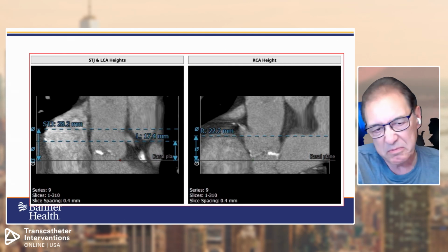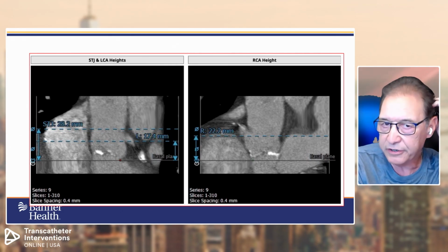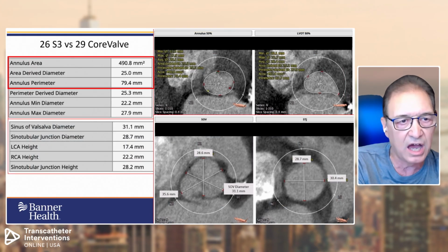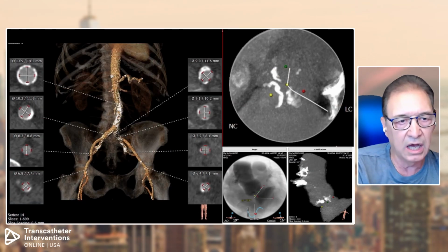We did the usual measurements in anticipation, and I promise this is not just a TAVR case. We did the usual measurements in anticipation of her being a TAVR. And there's some question about what do you do with patients with coronary disease? Do you even look at their coronaries in a patient like this? And we thought, because she was having really a progressive angina and probably had an ischemic cardiomyopathy, and looking at the CT results, the pre-TAVR CT, that we should look at an angiogram.